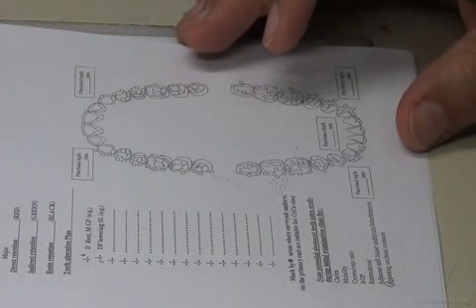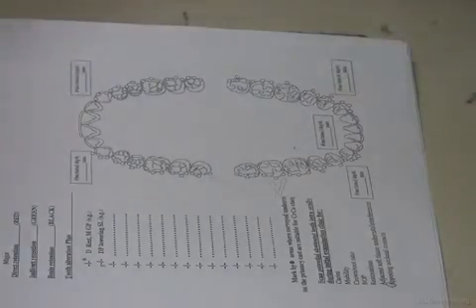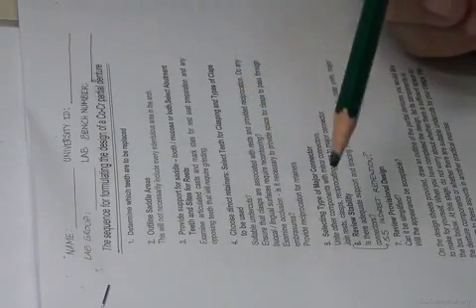So the empty form that we're going to fill in always is accompanied by the first page. It has the sequence of surveying on this side, the sequence of surveying of casts on this side, and then the steps for chrome-cobalt design, included on this side, okay? This is to remind you of each component, so you don't forget it while you are doing your design, and it also gives you some indication on how to review any design, okay?